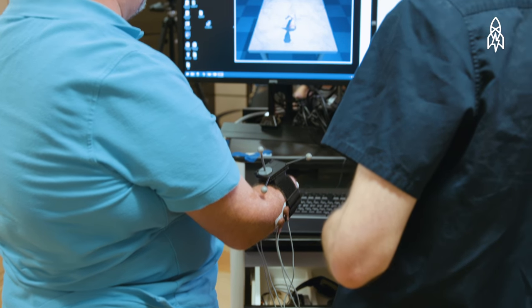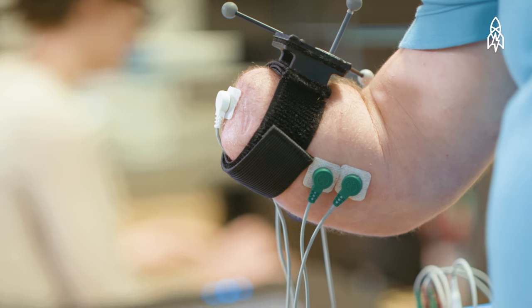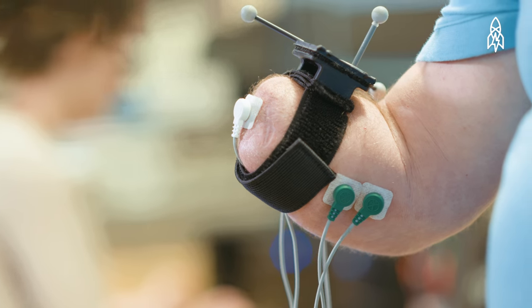The research that we've been doing is reconnecting the man to the machine. Basically learning how to take what the prosthesis feels and translate it so that the person using it feels it.